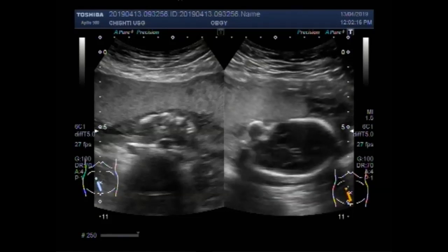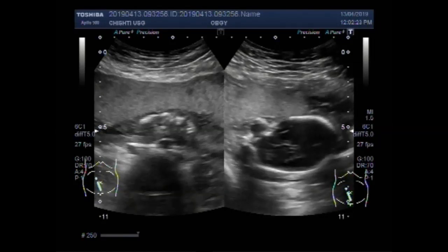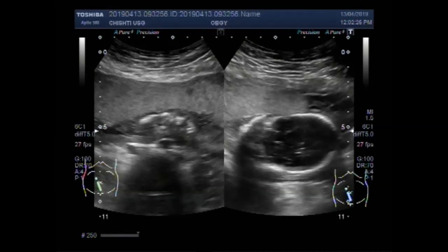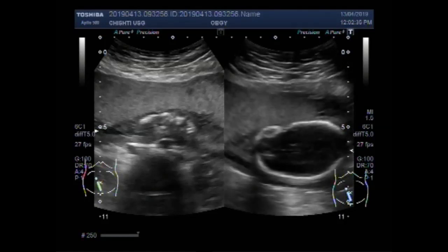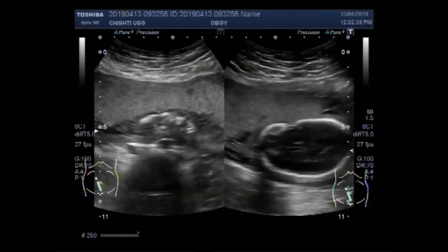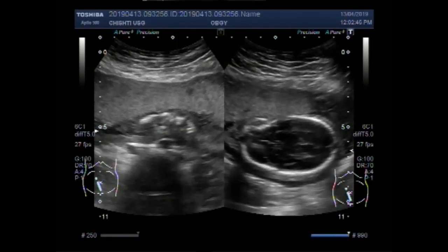This is the fetal head. This is the fetal brain. This is the fetal head and this is the placenta.